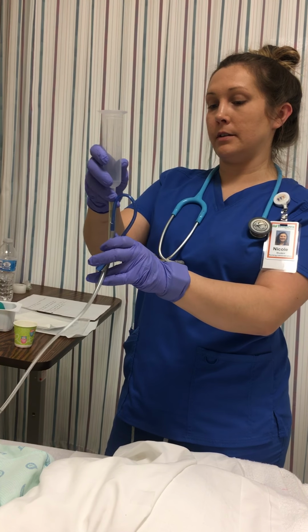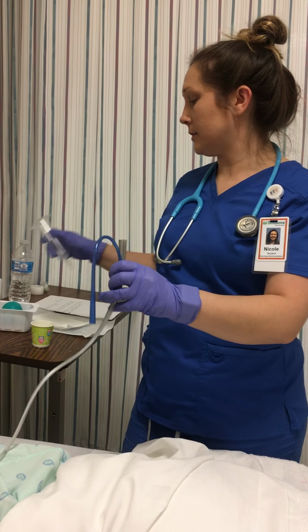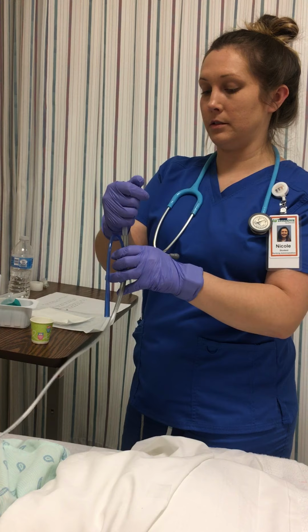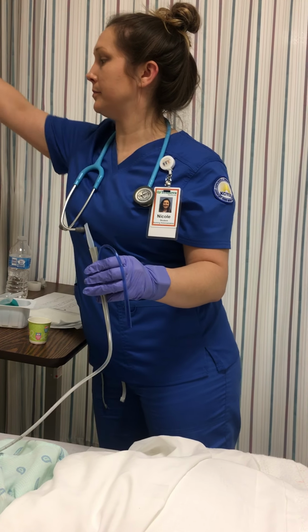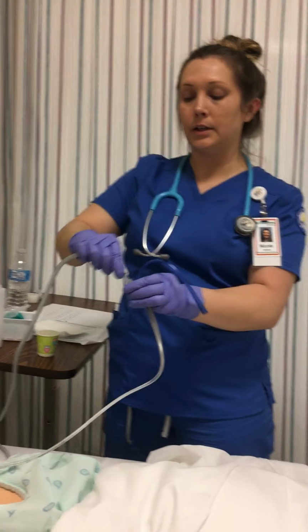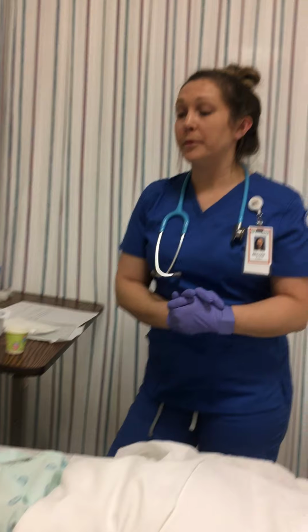Okay, so now that I've administered the Glucerna, I'm going to take this off and apply the suction, or just clamp it off per doctor's order. I'm going to assess the patient, make sure they tolerate it well. I'm going to document all my findings.